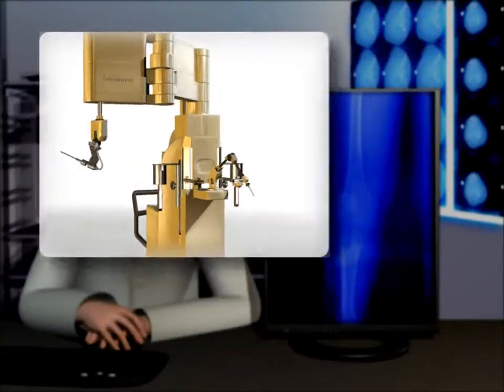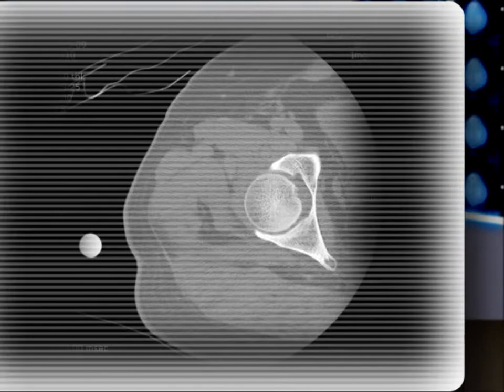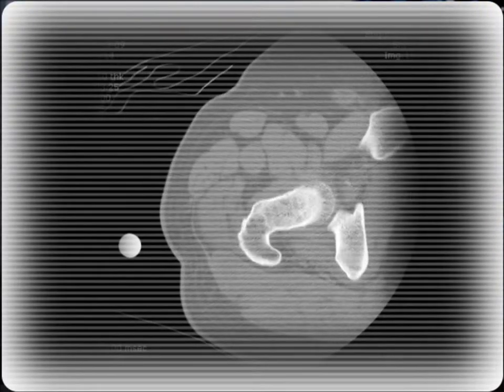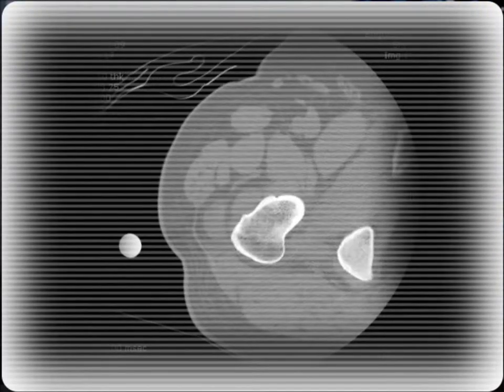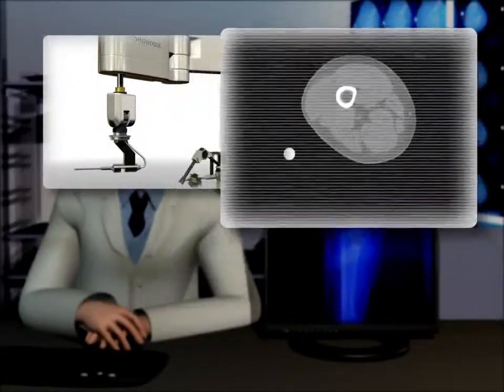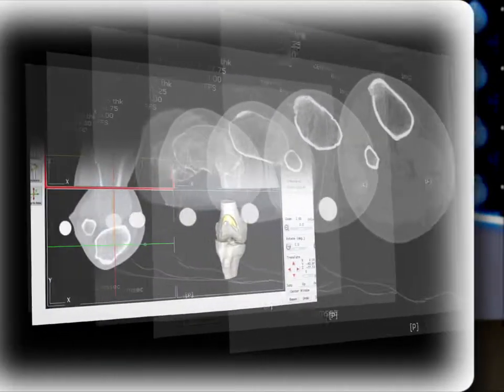The RoboDoc system THA procedure includes CT scanning, preoperative planning, surgery, and evaluation.